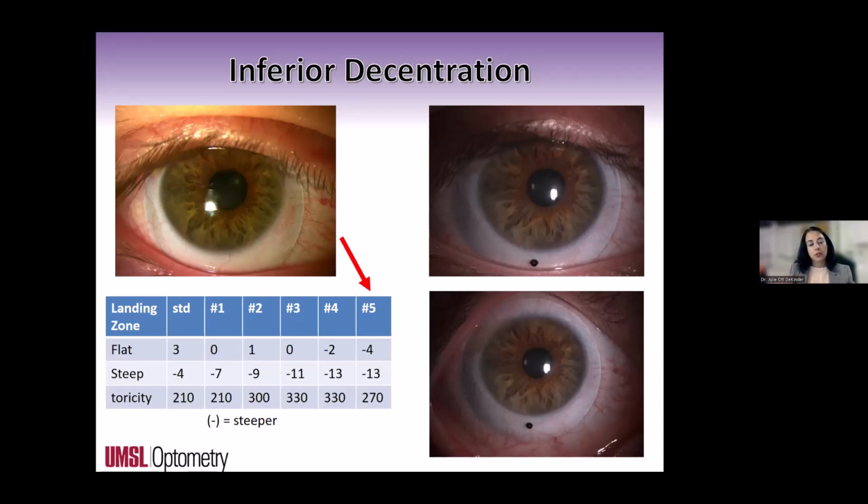So I called up the consultant and I said, there's something not right. The lens looks like it's fine. I don't really know what's going on. We cannot get this lens to center up. The consultant said, is it having a significant amount of astigmatism? And I said, yes, it does. Can we work from the inside out? And they said, yes, we can.